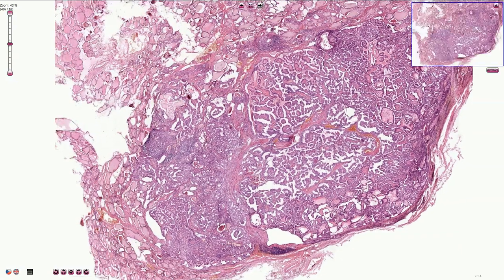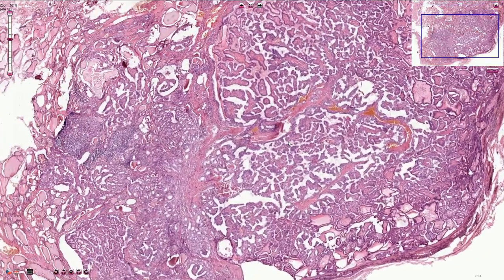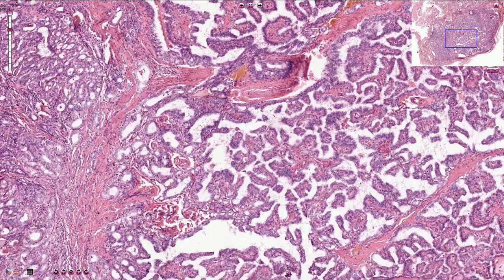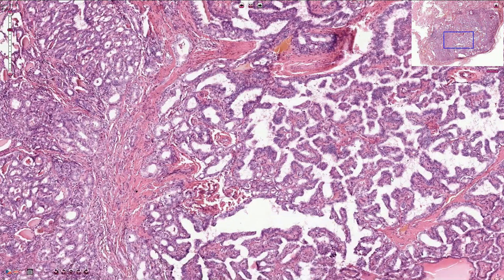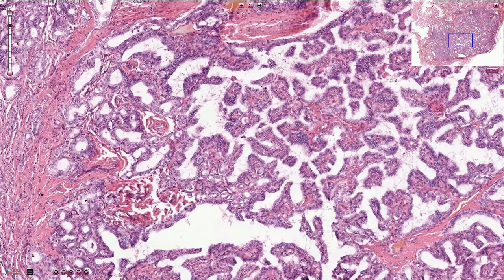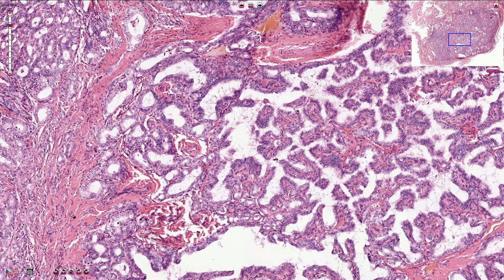However, all variants of papillary carcinoma should have typical nuclear features. In the papillary type of growth we can recognize true papillary structures with thin fibrovascular cores — the core of the papilla contains small blood vessels with fibrous tissue. In other parts, the tumor forms follicular structures.